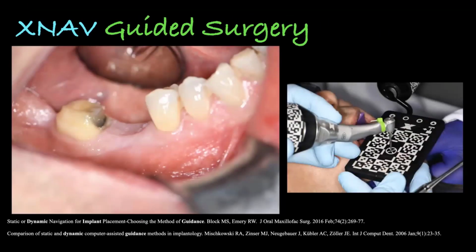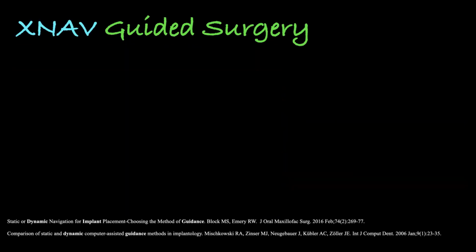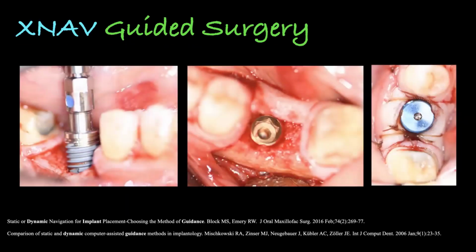And so in a case like this, for instance, you just mark where you are. You're going to place an implant in a specific site. You're able to place an implant. It is freehand, but because you're using target practice, looking at the screen while you're doing it, you really are able to get a very good result. But you're also able to pinpoint exactly where you should be and what you need to have happen. So that's pretty cool.